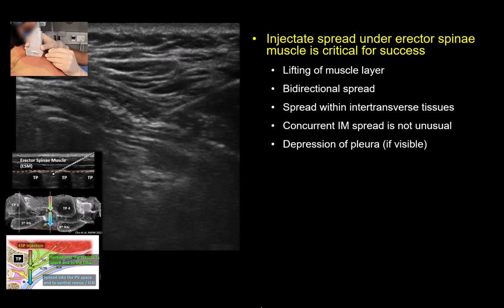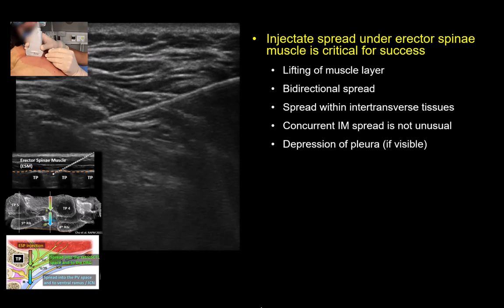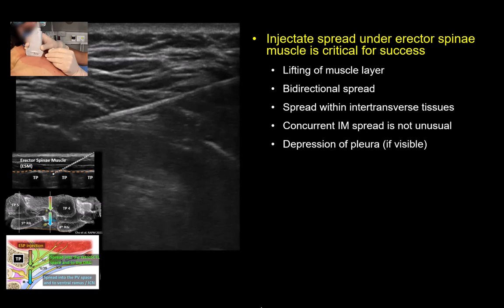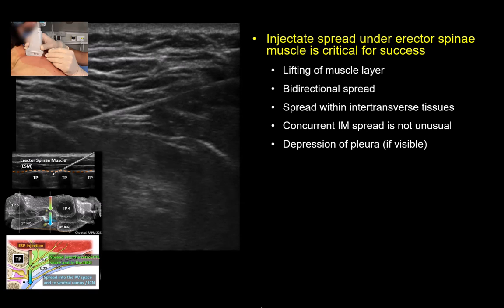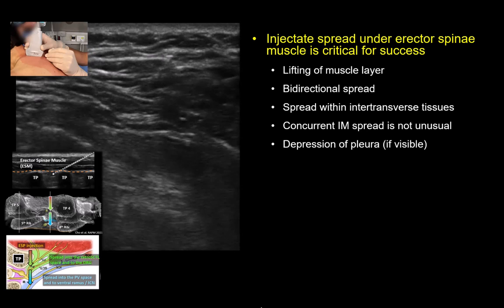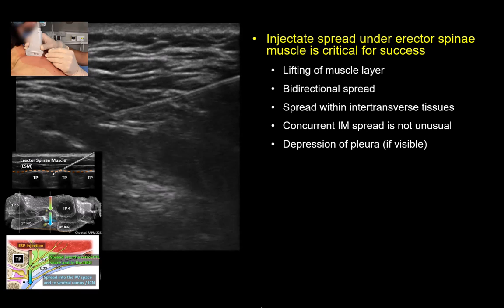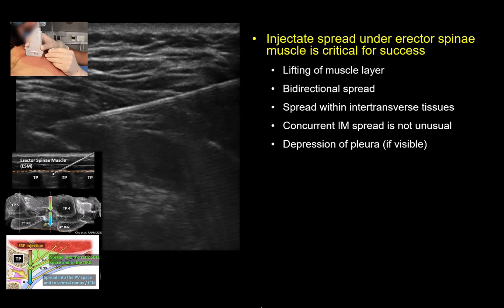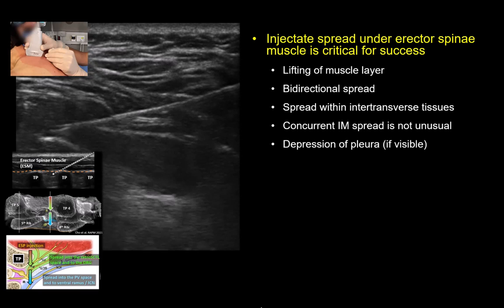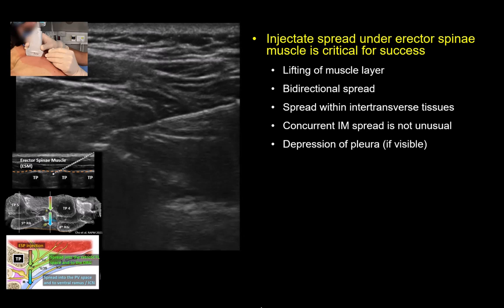The correct injection pattern to look for is one that occurs deep to the muscle and its investing fascia. Our most up-to-date understanding of the mechanisms of the ESP block indicates that this is essential if we want to block the anterolateral torso and the territory supplied by the ventral rami of the spinal nerves. The injectate should lift the muscle up rather than distend it, and fluid is often seen spreading both cranially and caudally. It's not unusual to also see spread within the muscle as the fluid tracks back along the needle shaft, but this should not be the only spread pattern. Perform a dynamic scan as your assistant injects to continually assess the spread and confirm that the tip is indeed lying deep to the muscle.